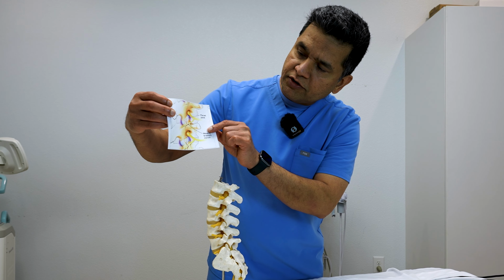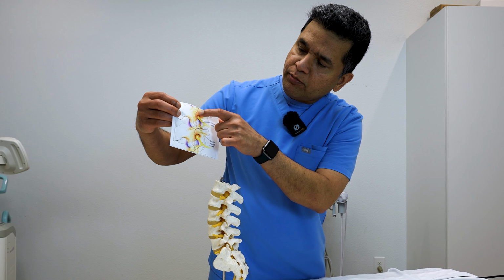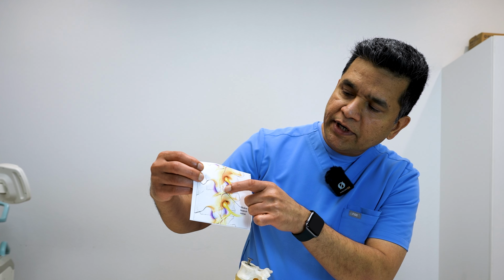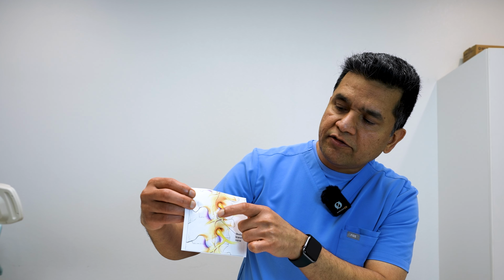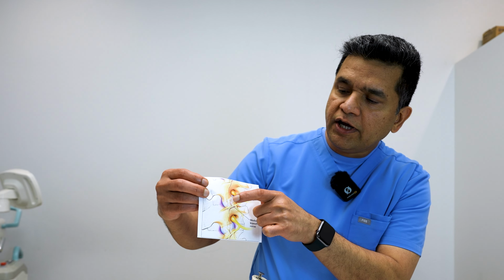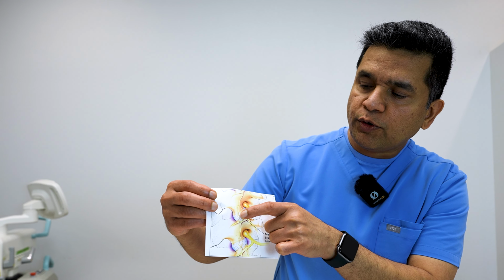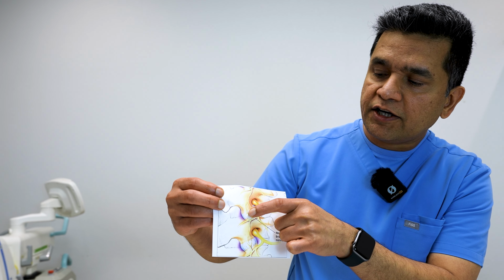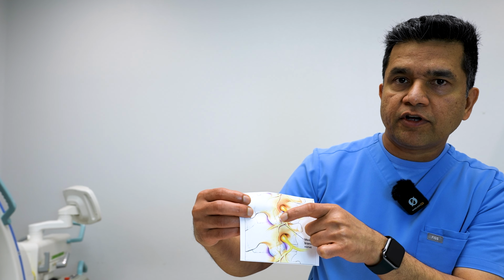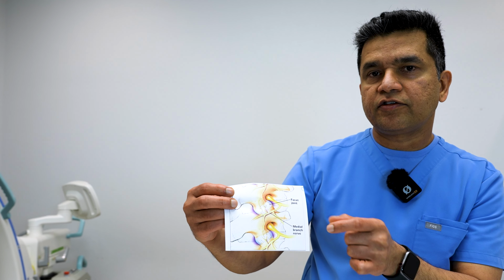And this picture shows it a little more in detail. You can see each of the facet joint is supplied by 2 small branches from the main nerve root, and they're called the medial branches. And they take pain signal of whatever sensation from these joints. So if you're able to target this small nerve and inactivate it, then you could get pain relief from arthritic pain from the small joints. And that's the philosophy behind this treatment option.